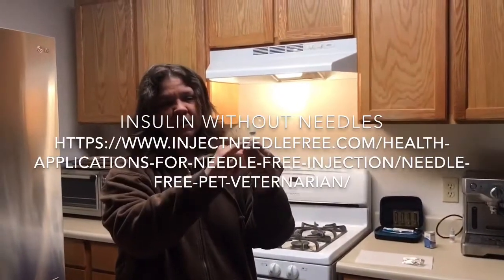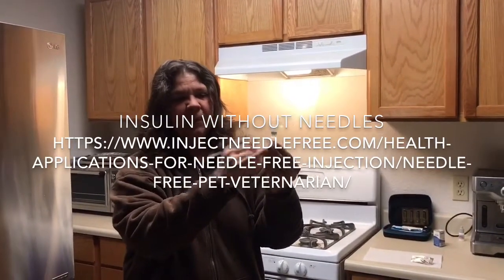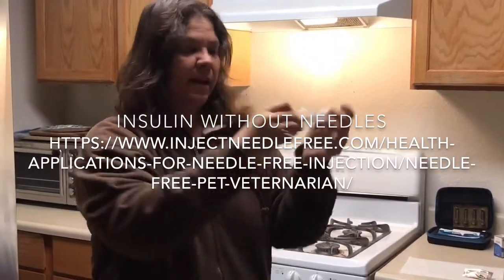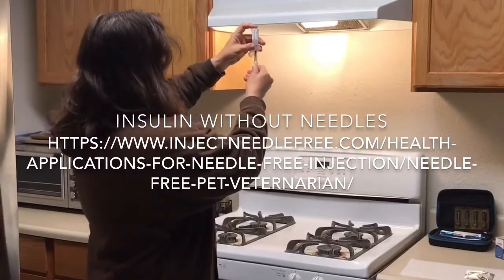You can see there's an adapter that goes on to the insulin bottle and then your needleless syringe. You just screw the syringe into the adapter, pull your dose, and detach the syringe.